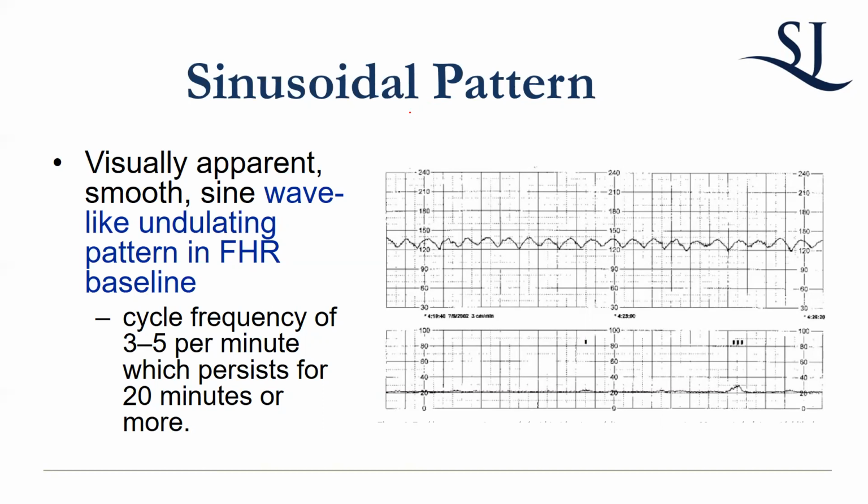If you're tested on it, it kind of looks like atrial flutter on an EKG. It's supposed to be a sinusoid, like that, but it looks more like this, which is not really sinusoid. It looks more like a flutter pattern. This is really academic more than anything. You won't really see that just because if you're seeing this, it's usually a late stage result, and either there would have been a poor fetal outcome, or you're looking at a category 3 tracing, which you could do something about. But just keep in mind what that is if it comes up.